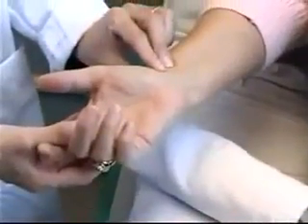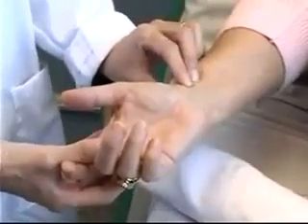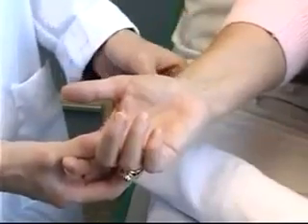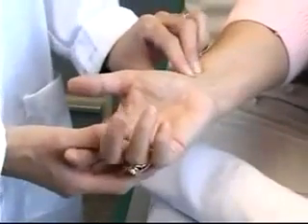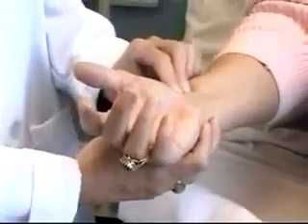We'll begin the procedure by performing the Allen's test. The most common site chosen for blood gas sampling is the radial artery of the non-dominant hand. Once you've chosen the hand, before you can proceed with the procedure, you must first perform an Allen's test, which indicates whether or not there's collateral circulation to the limb.